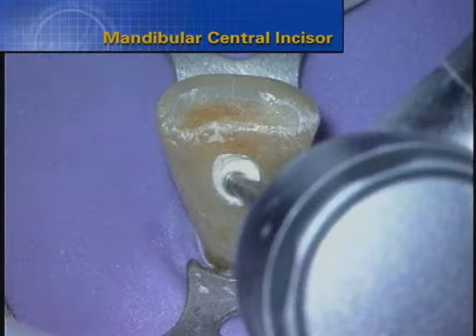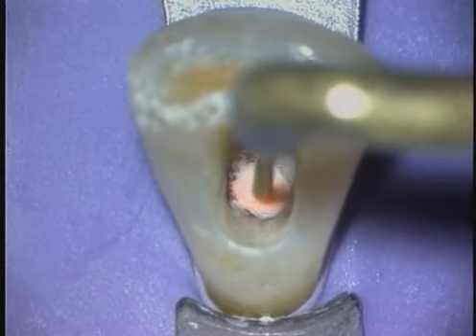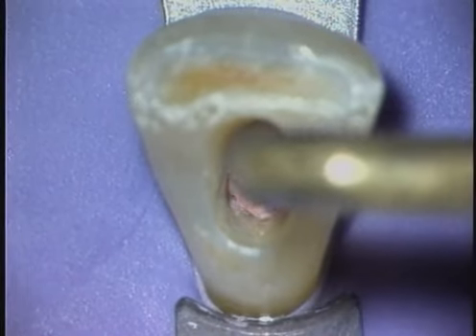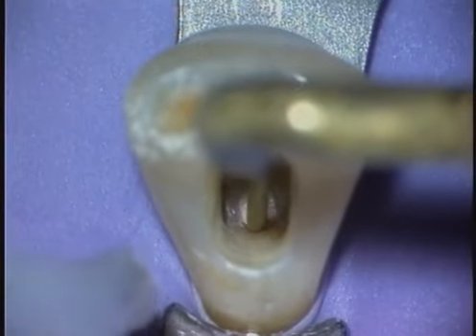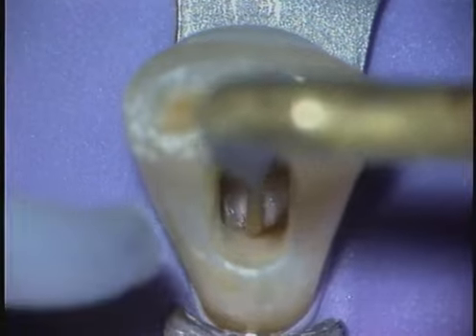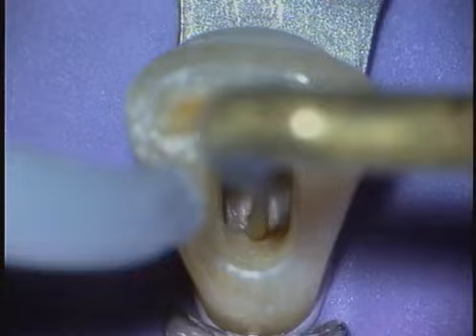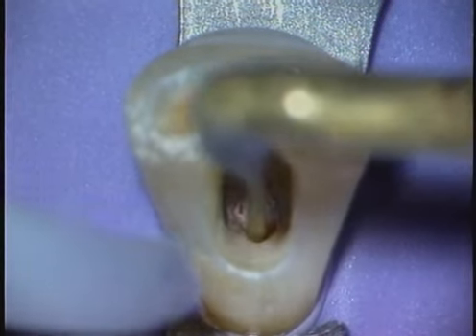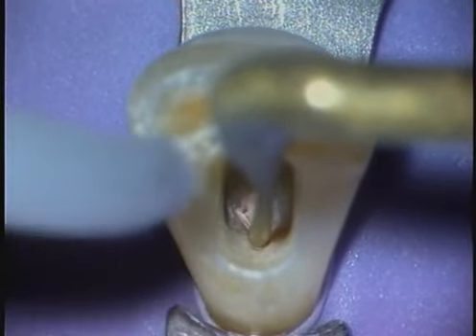When accessing mandibular incisors, we need to always be aware of the possibility of an extra canal. Microsonics is a combination of ultrasonics and magnification with the microscope, and this affords unsurpassed vision when working in these very small teeth. The canal that's typically located is the facial branch. The one that we usually don't find, and the one that we should suspect, is more lingual. Therefore, access cavities have to be driven towards the lingual at the expense of the cingulum.